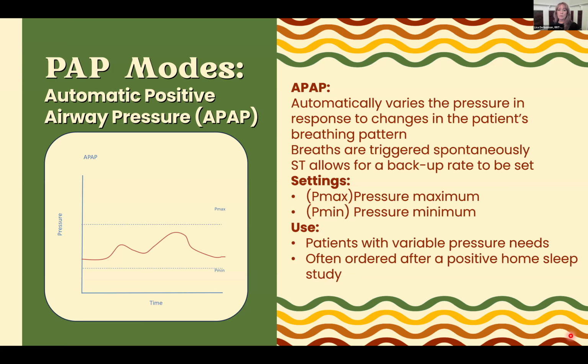And again, used for patients that don't need the same support through all stages of sleep. And AutoPAP is often what's ordered with home sleep testing. They're not in the lab getting that titration, so a lot of providers will just set them up with AutoPAP after that.